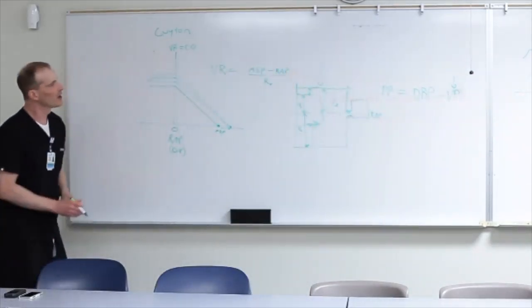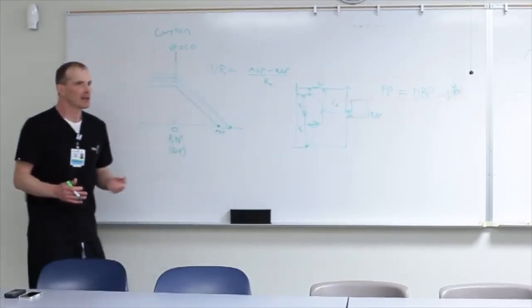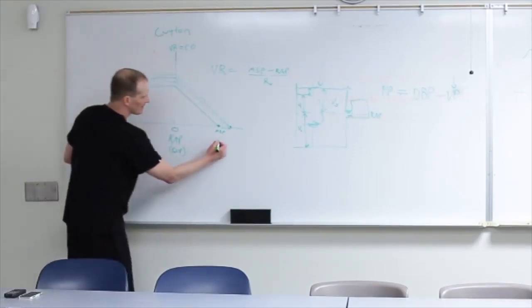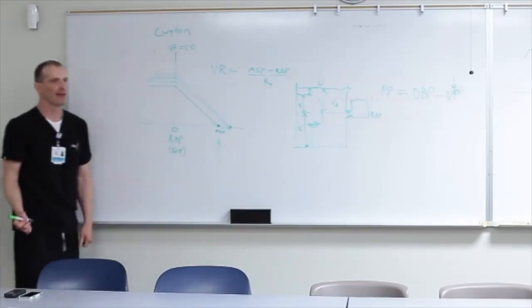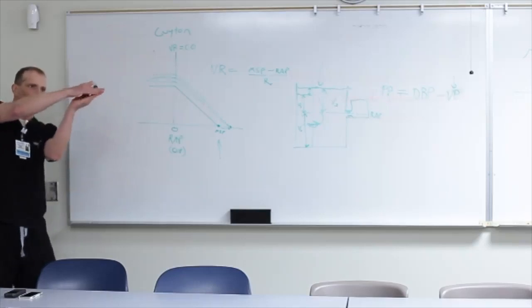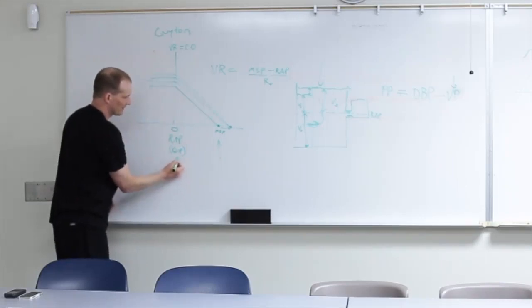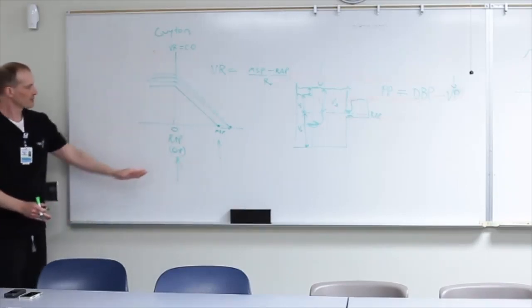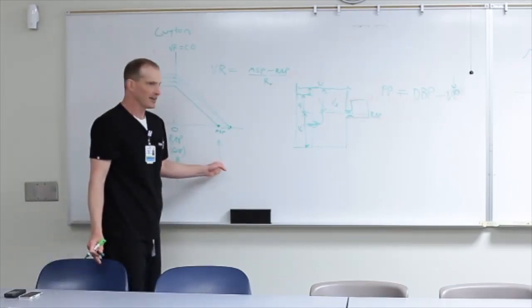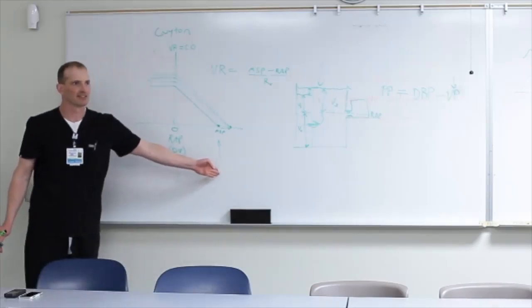Okay, so we've got the IVC. We usually aren't doing Doppler in the IVC, we're just looking at the IVC, right? So an IVC that's big and fat and not collapsing is here-ish, okay? And a completely flat one, never opening up except for little blips like this with respirations, is here, okay? So this person needs either fluids or a vasopressor, right? And this person here needs some diuresis, okay?